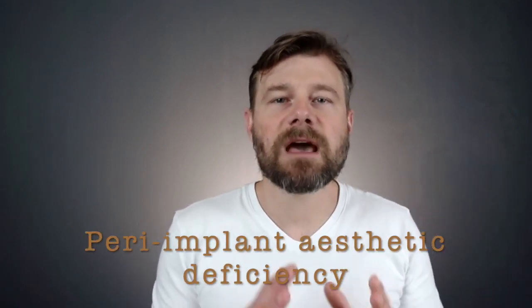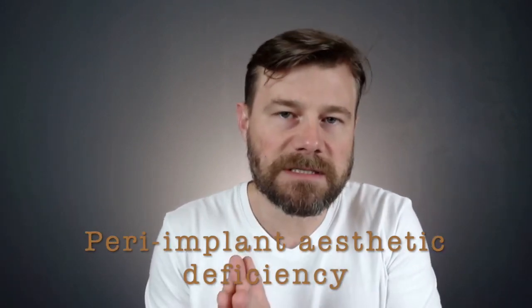I'm here to present a series of cases for you that are going to bring a very nice subject: how to treat and how to choose the right approach for aesthetic deficiency of peri-implant tissue in the aesthetic zone. In these cases, we receive patients with the implant already in place and some problems to treat.